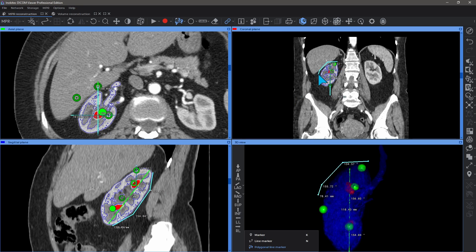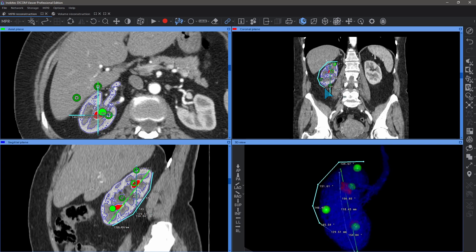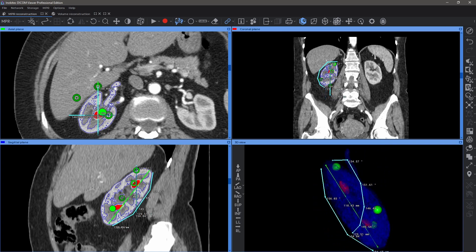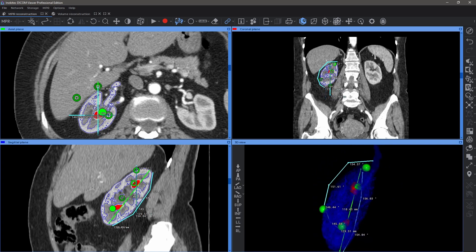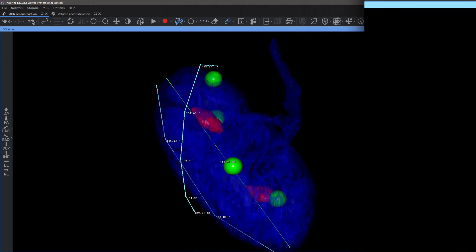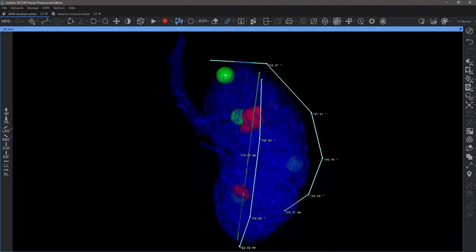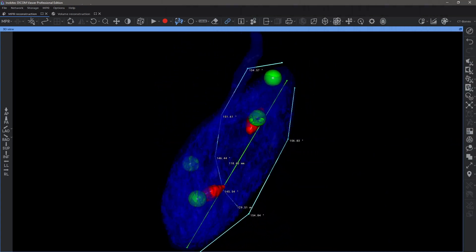All lines and markers support line name, color, and line weight settings. Location of the markers and their parameters are saved with a segmentation project.